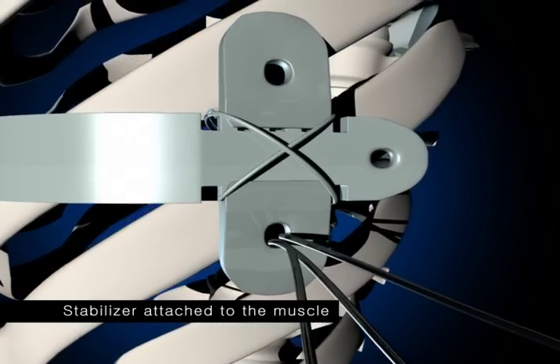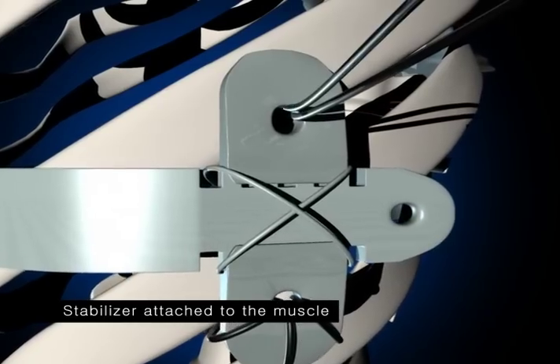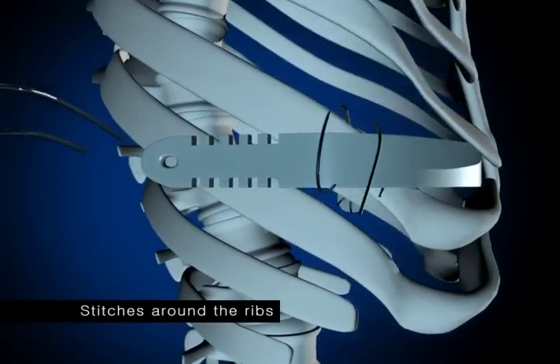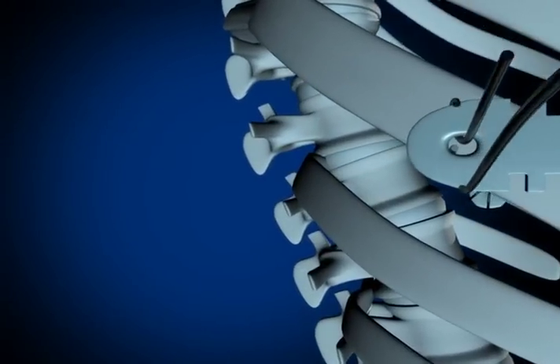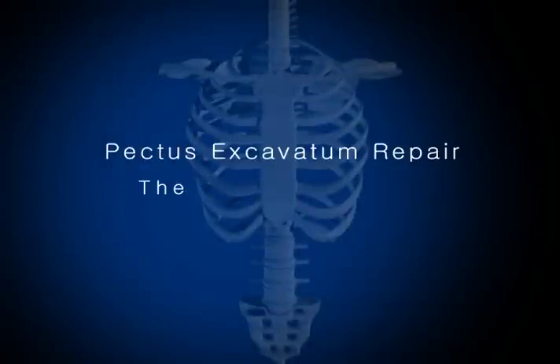It's then secured by means of metal stabilizers through the ribs on either side. The correction is physical right away after the bar is put in place to move the sternum to the desired position.